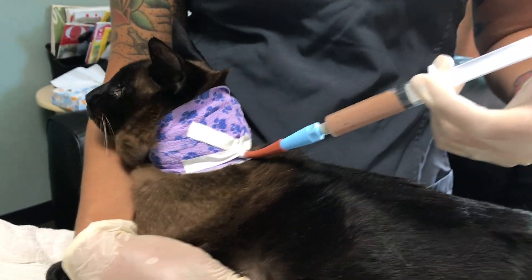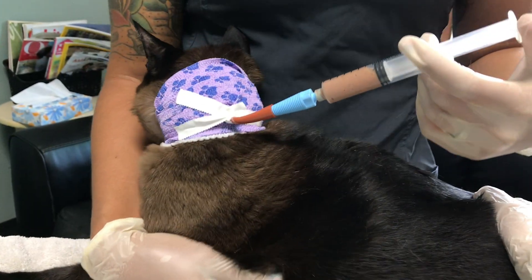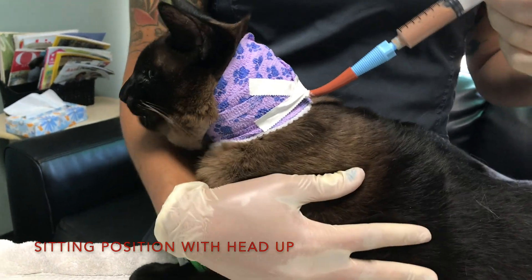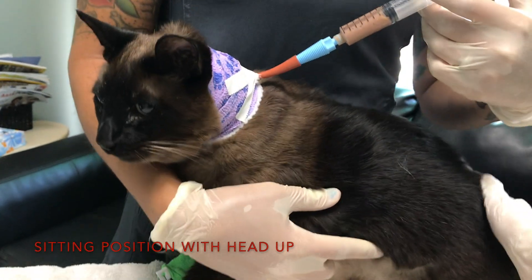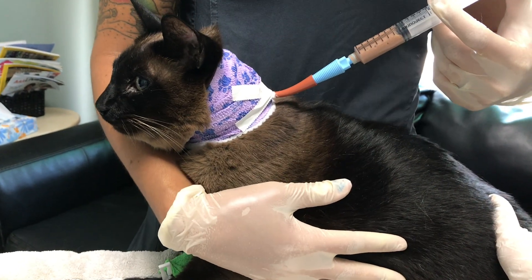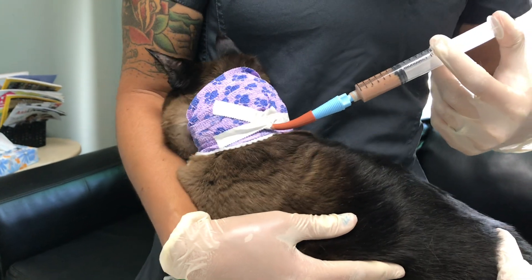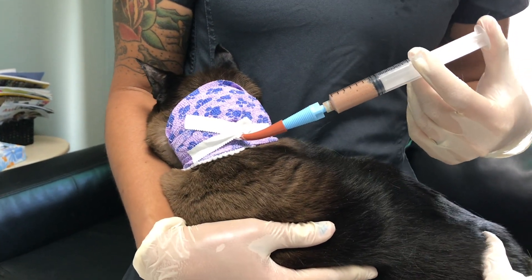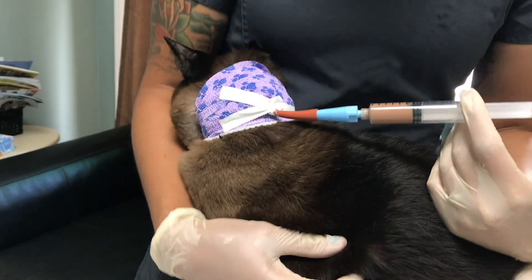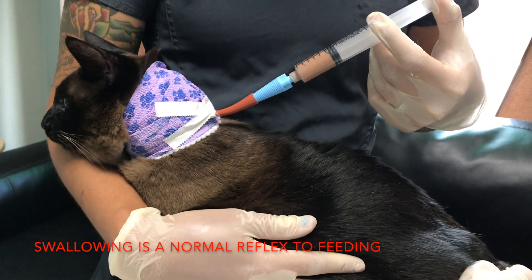As you can see there, hopefully he just swallowed for us a little bit. You do want them sitting in an upright position, or what we call sternal, versus laying on their side or sleeping — because we want them to swallow, and if they're laying on their side or in an odd position, sometimes the food can kind of flow back out of the stomach and cause them to regurgitate a little bit. So this is a perfect position for any dog or cat with a feeding tube in.